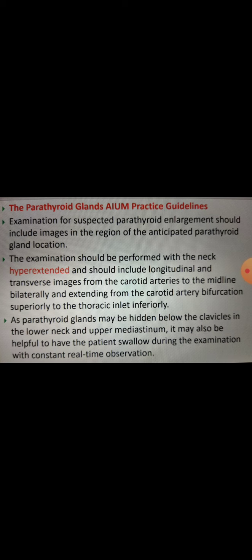Whenever you are able to visualize these glands, that means the size is enlarged, or there can be some pathology. That's why you are able to visualize it in ultrasound, although the normal parathyroid gland is not easily visualized on ultrasound. So now we will discuss what our practice guidelines say.